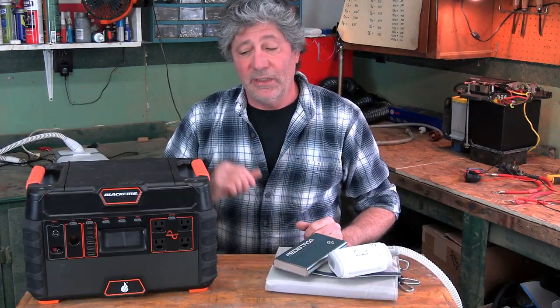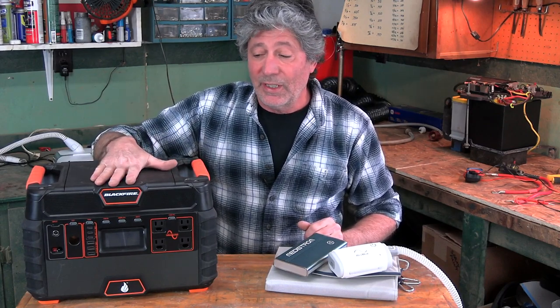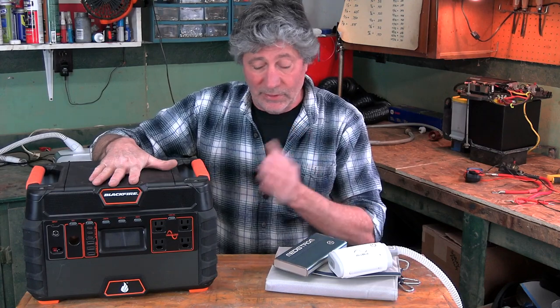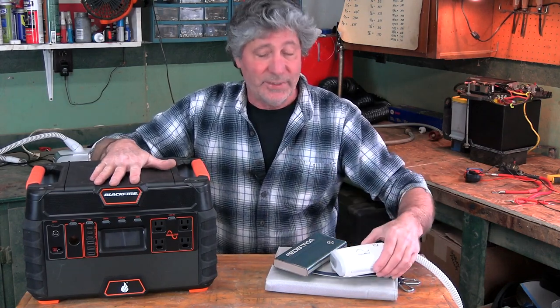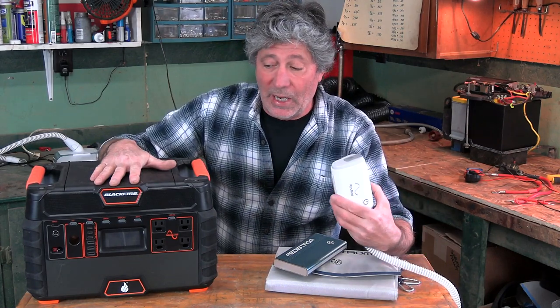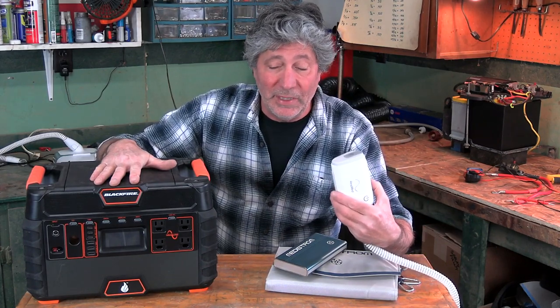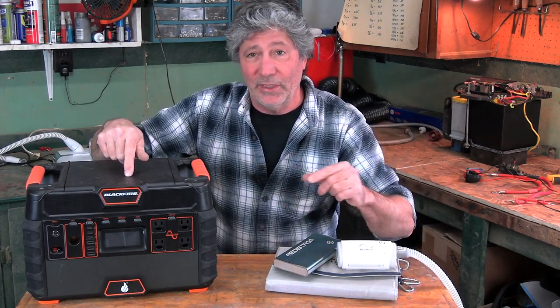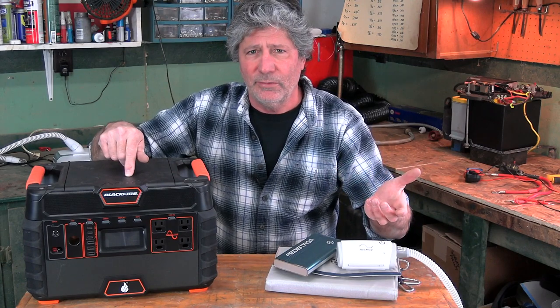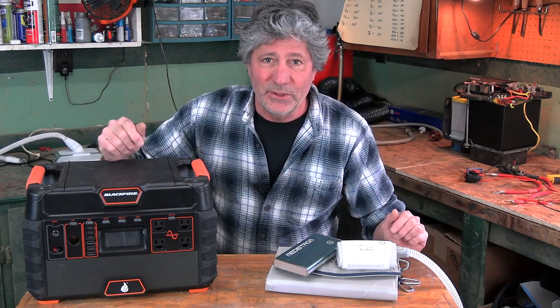Now, if you don't mind carrying some bulk and weight, this larger power unit — I haven't tried it out yet, but it's like 95 amp hours and would power this little CPAP for I'm guessing a week or maybe even more without recharging. I put a link to it and a code for about 10% off in the video description as well.